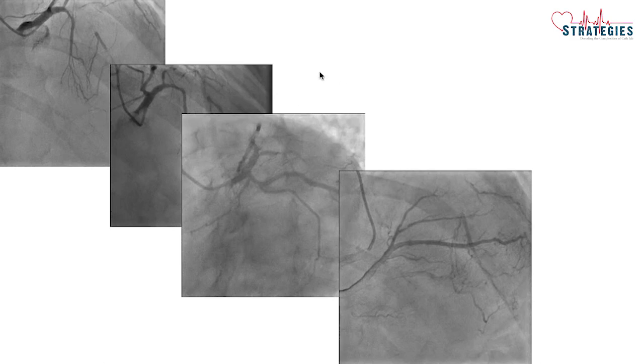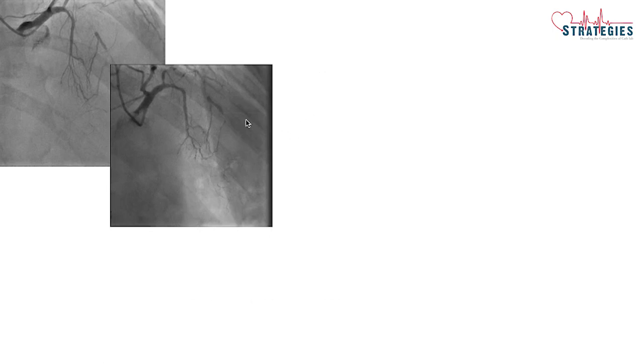And if you see the length of the CTO, it looks around 20 millimeters, so it comes in the long segment CTO.